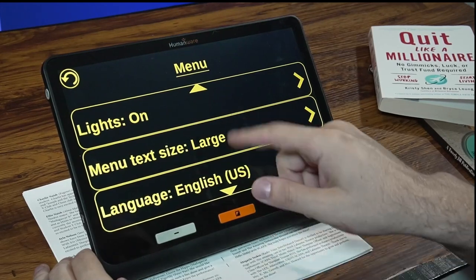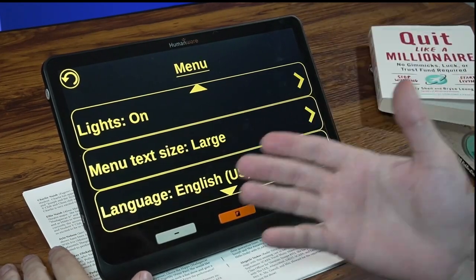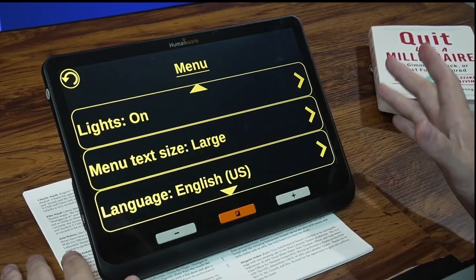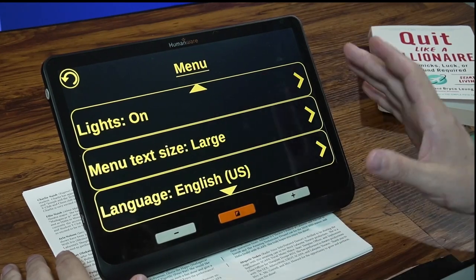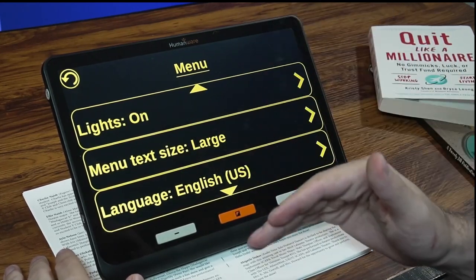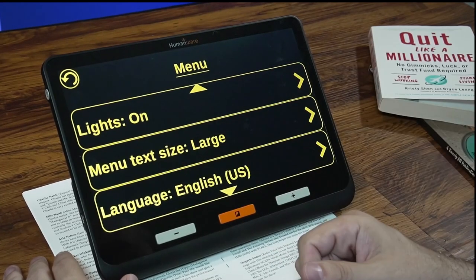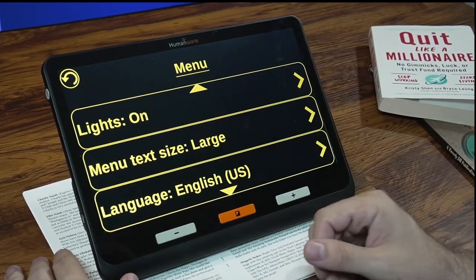One thing to note: I have the menu text set as large as it will go — the options are small, medium, and large — and even at the largest setting, it's not quite large enough for me to see clearly. I wish the text could be made larger, or that the menus would read out loud when touched. That would make it much easier to interact with the menu.